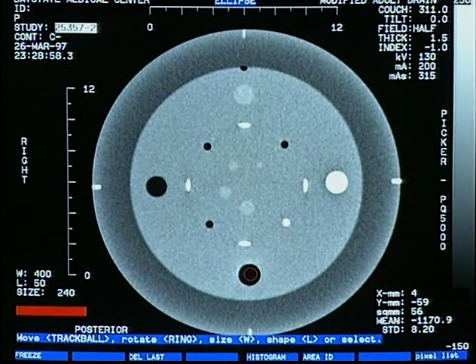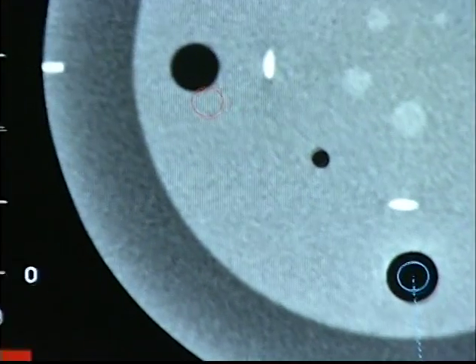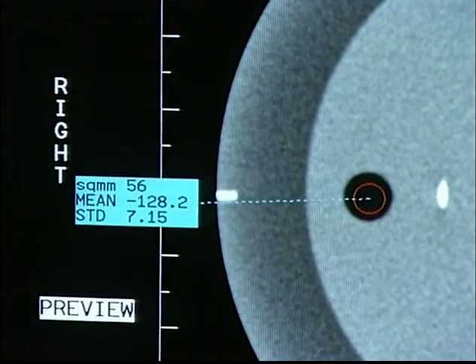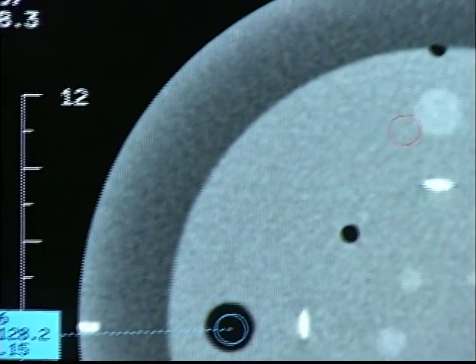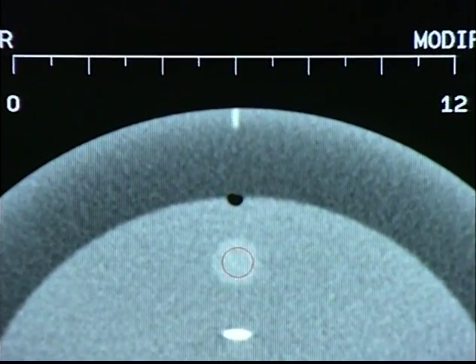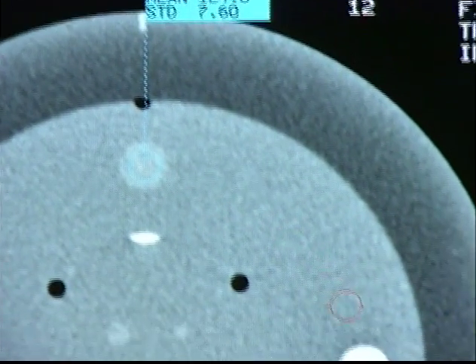Surrounding the ramps are 4 sensitometry or CT number samples. These are made from air, LDPE, acrylic, and Teflon. The samples allow you to monitor any possible CT measurement problems resulting from scanner drift. This evaluation of CT linearity is extremely important when evaluating CT scanners used for treatment planning.